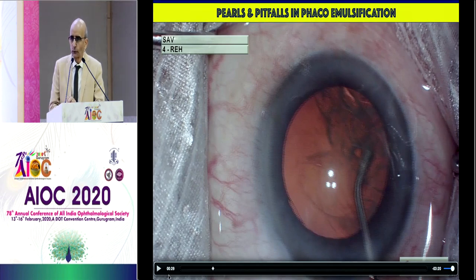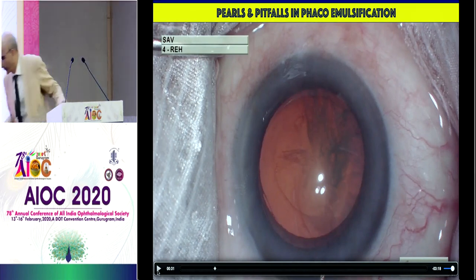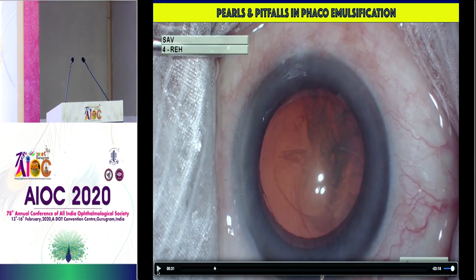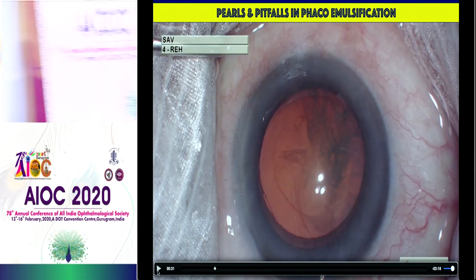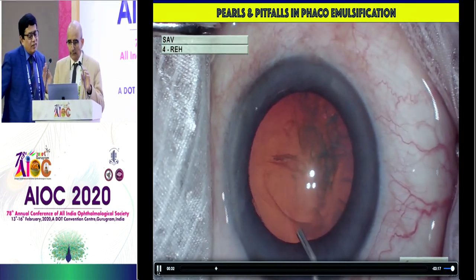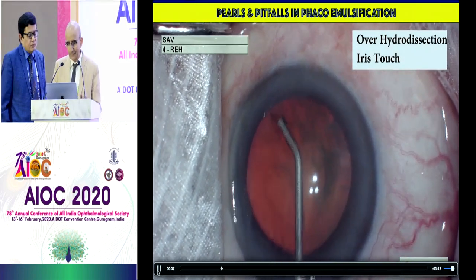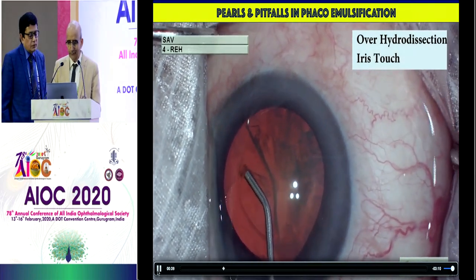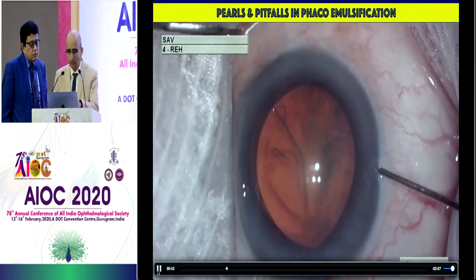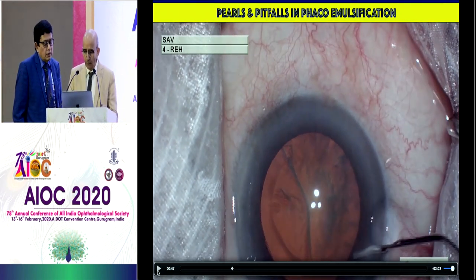The cannula touched the sub-incisional iris. Nobody noticed actually, but that little thing was again more fluid, and if you show the peak there, you saw the peak of the iris coming — the little trauma. The first thing we want to do is to resist this. The first reflex is to push from the main incision with a spatula or a cannula or viscoat or something and push it back. Do not do that. Do not go to the main incision.